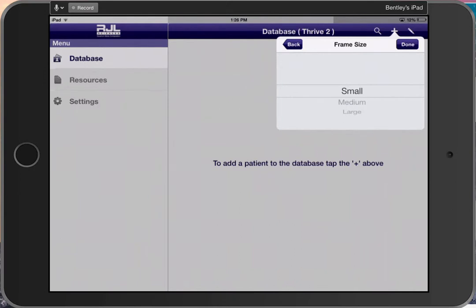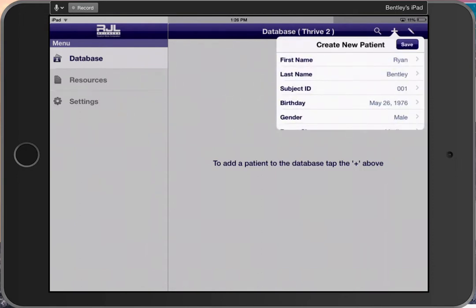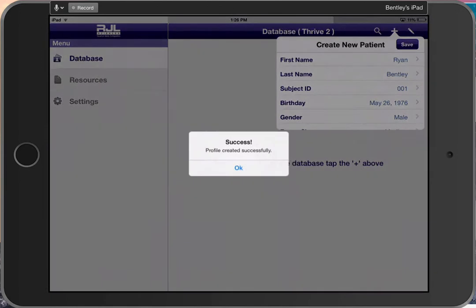If the fingers just touch, if the fingertips just touch, they're medium framed. If they overlap, they're considered small frame. And if there's a gap between the tips of the thumb and middle finger, then they are considered large frame. It's a great way to determine that. It's nice and easy. Now you hit save.